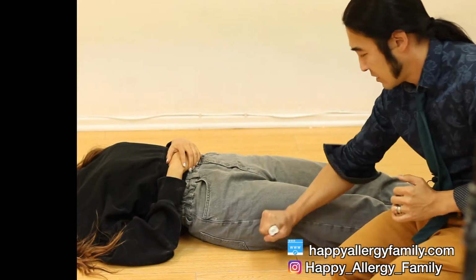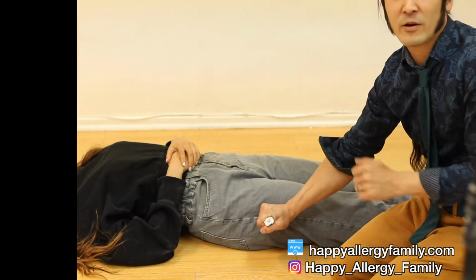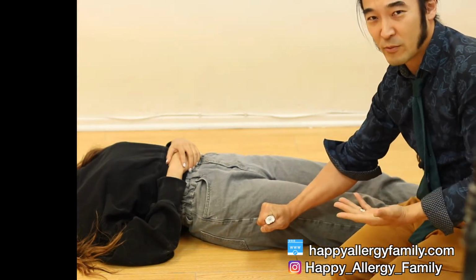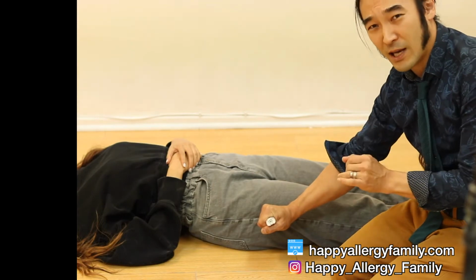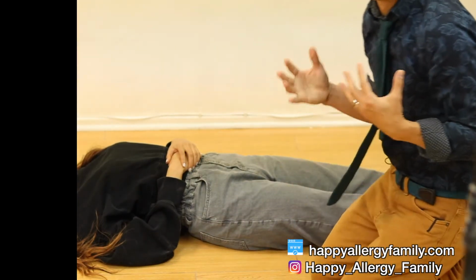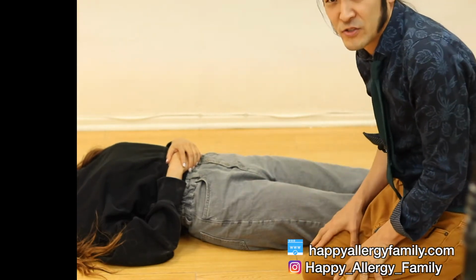So we're going to take it, apply force. You hear that click. We're going to count to 3 slowly. 1, 1,000, 2, 1,000, 3, 1,000. The medicine has now been applied. I'm going to slowly remove it. And then, of course, we're going to follow up by calling 911 for help, and we're also going to check to see how she's doing.